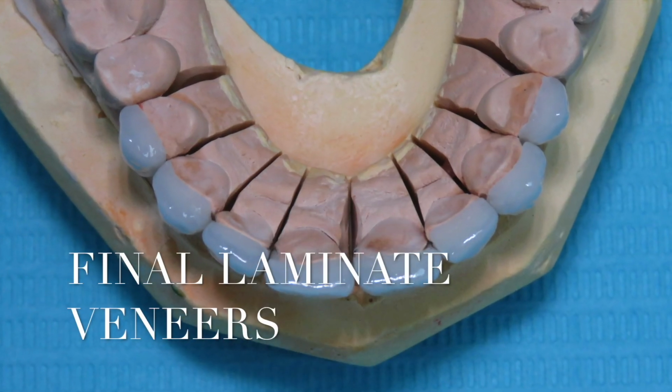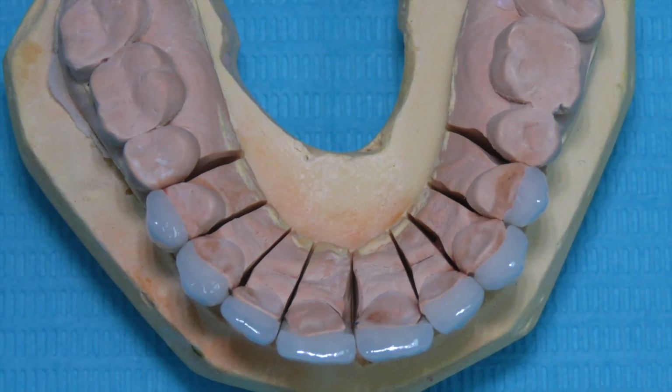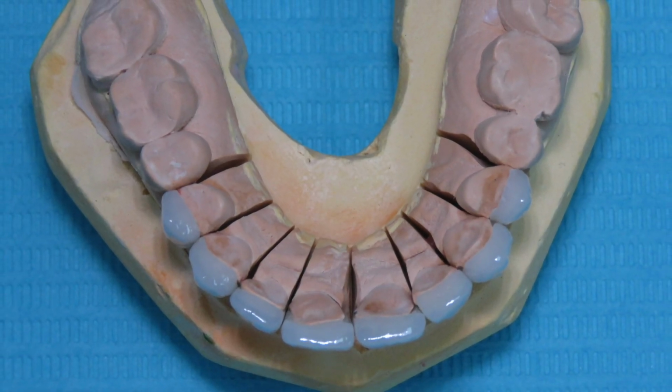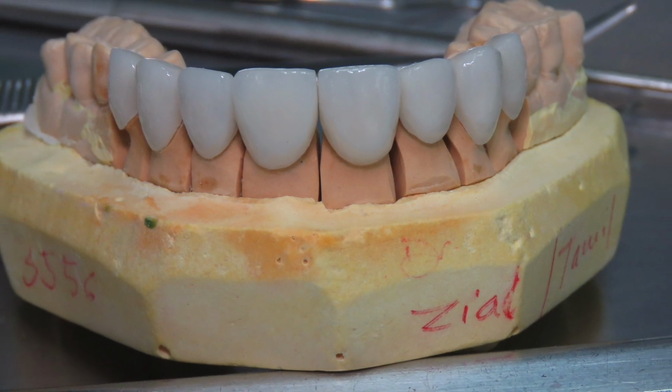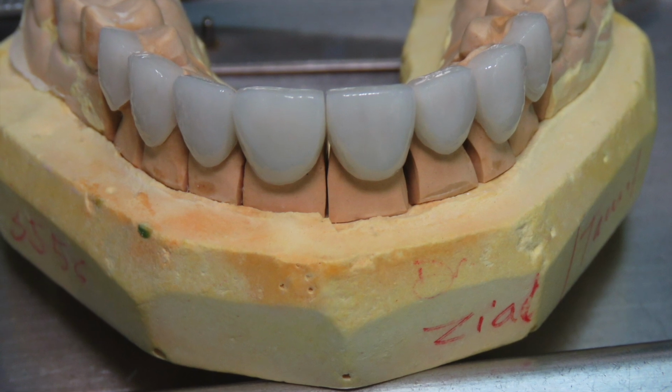These are the veneers after having them from the labs. Again, you see them here on the conventional impression. These are conventional dies, conventional stone models.